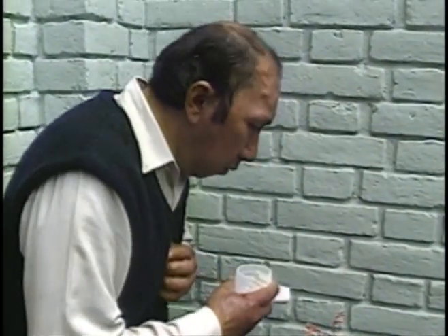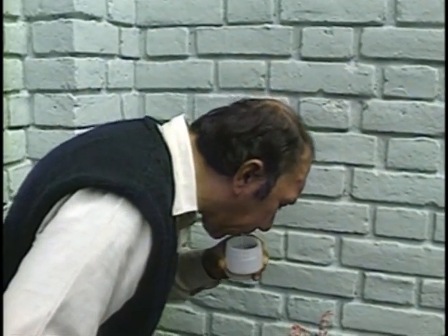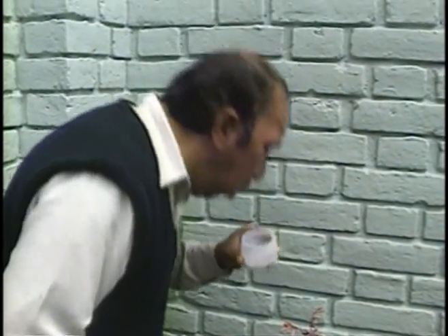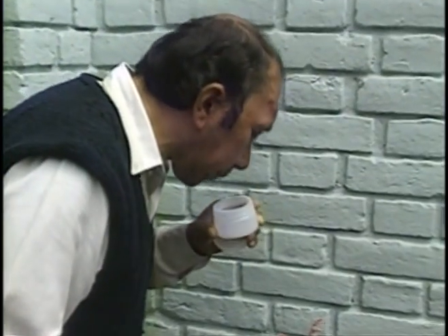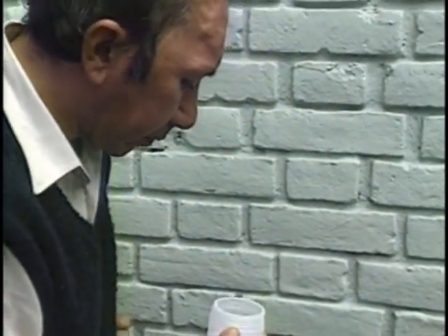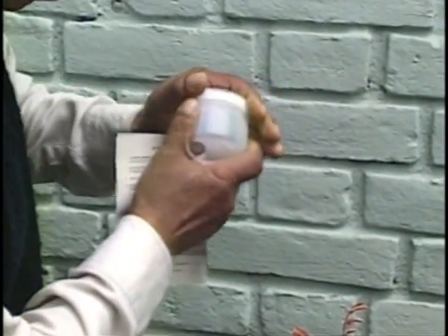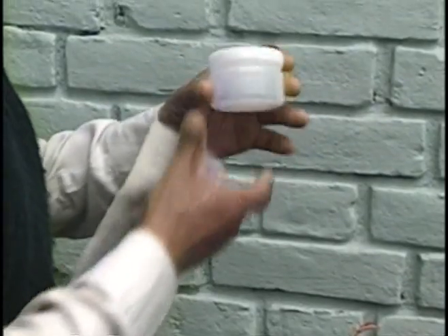Since TB patients are sometimes directed to the lab for sputum collection, precautions must be taken to minimize the risk of exposure. Never collect sputum specimens inside the clinic or laboratory. It is safer to collect the specimens outside. At all times, avoid creating aerosols in the lab. A daily routine that is followed exactly will help maintain safe conditions.